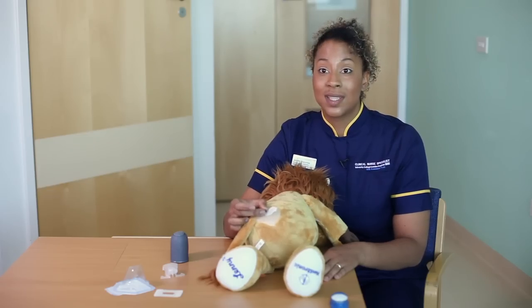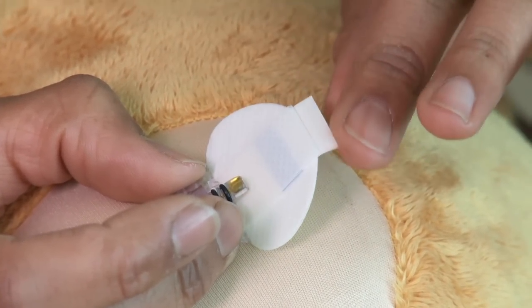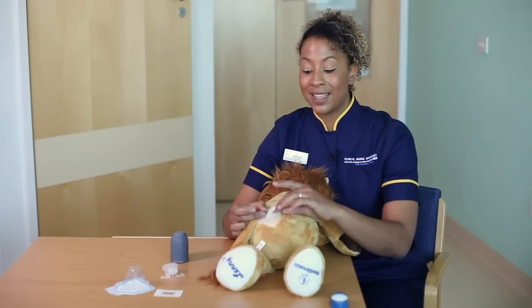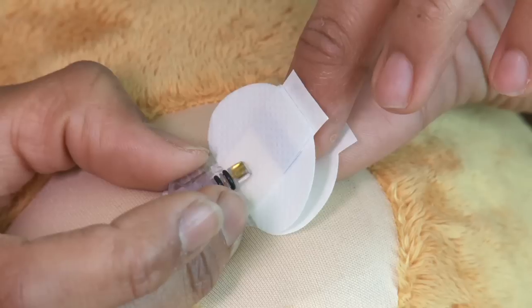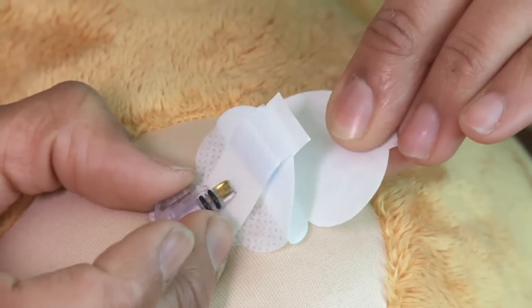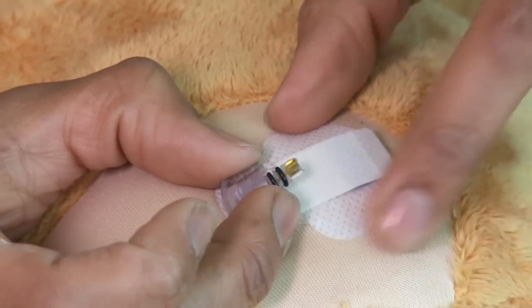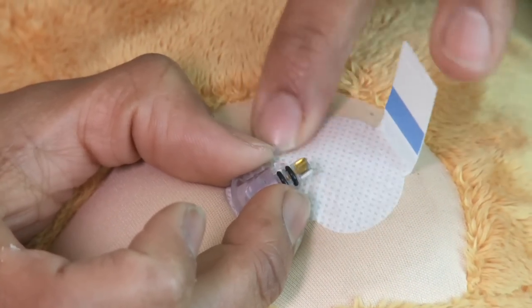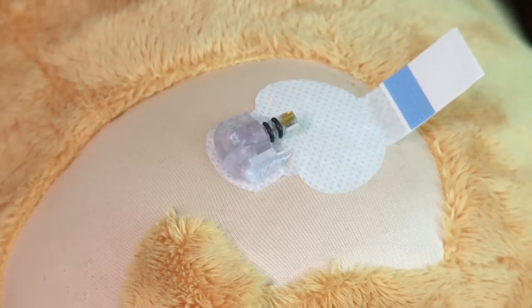Continuing to hold the sensor down firmly in place, we're now going to remove the plastic from the dressing. The plastic is concertinaed underneath, so find the bottom tab and pull that away. Make sure the sensor is stuck down nicely. Now we need to make sure the sensor is well stuck down using the dressing that comes in the box.